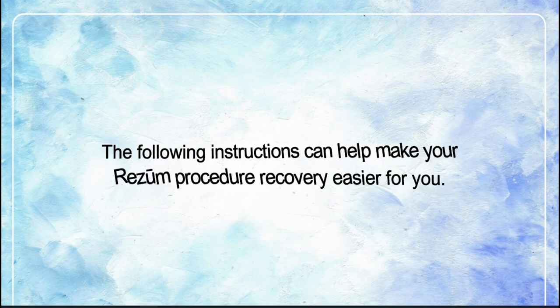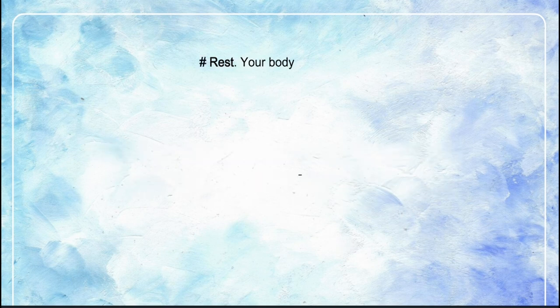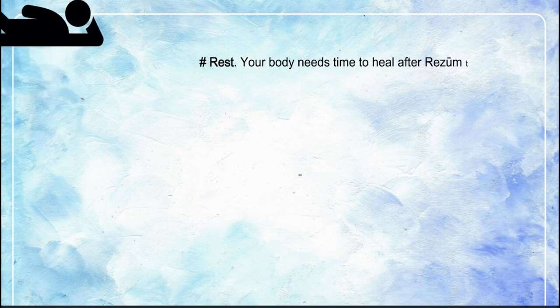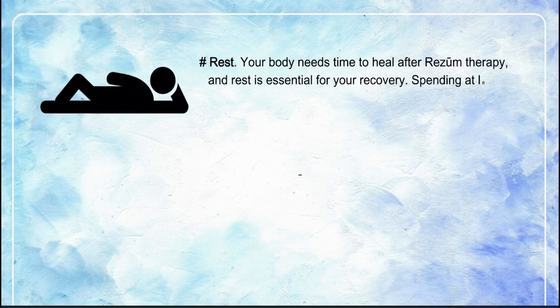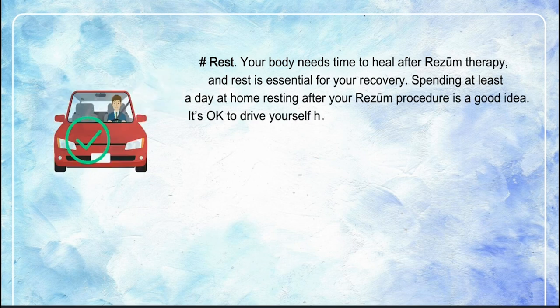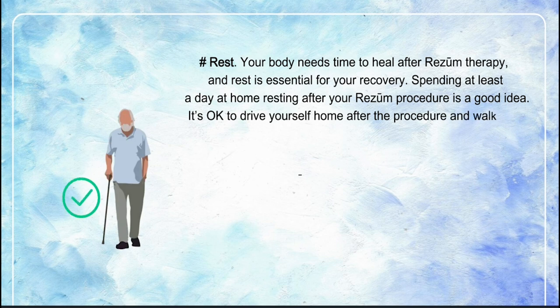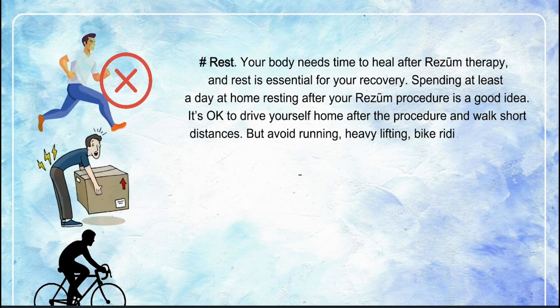The following instructions can help make your Rezūm procedure recovery easier for you. 1. Rest. Your body needs time to heal after Rezūm therapy, and rest is essential for your recovery. Spending at least a day at home resting after your Rezūm procedure is a good idea. It's okay to drive yourself home after the procedure and walk short distances, but avoid running, heavy lifting, bike riding, and other strenuous activities for a few weeks.